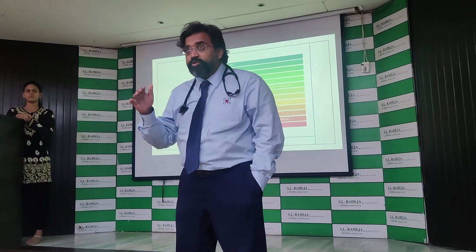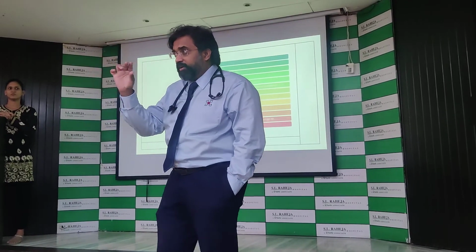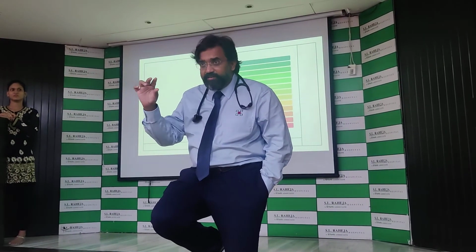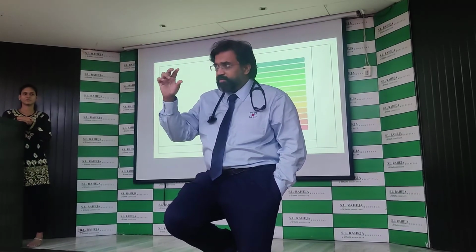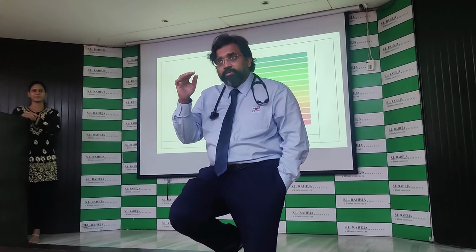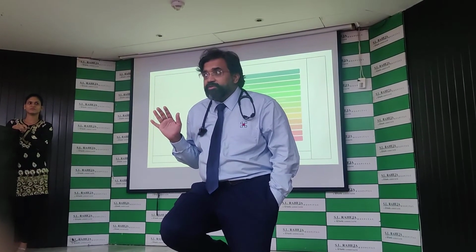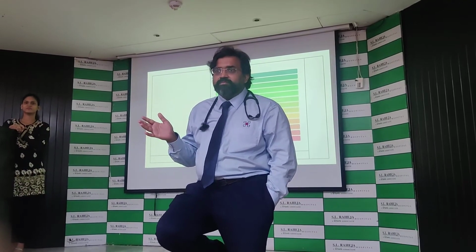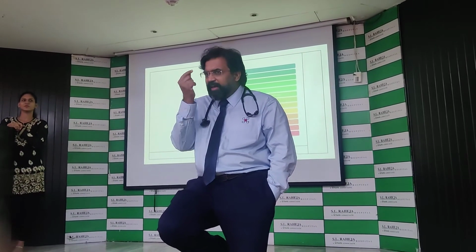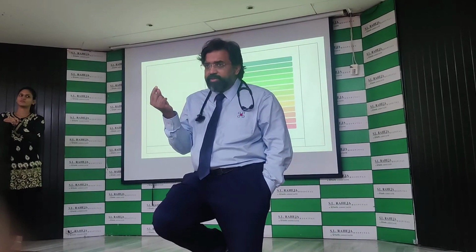Since the compliance has gone down, the box has changed from a normal box to a smaller box, a restrictive disease, ARDS type. So it becomes restrictive and the compliance has come down. What is the ventilator doing? It says, I am not going to give large tidal volumes; more RR. That's why it increases the RR. So the only parameter in this ventilator that you may have a problem with is the PEEP.